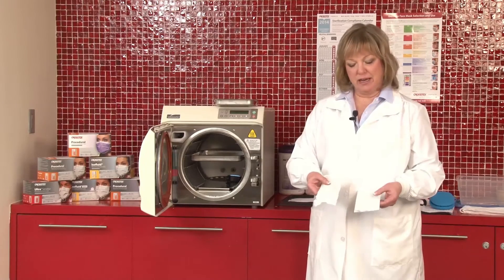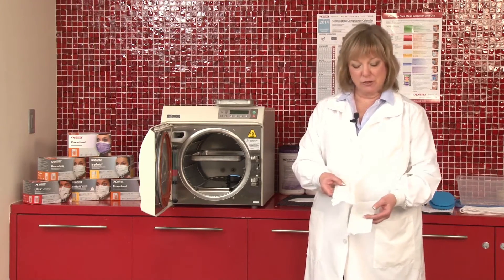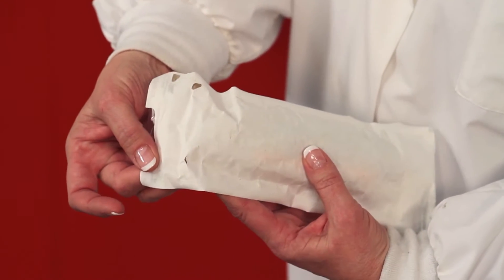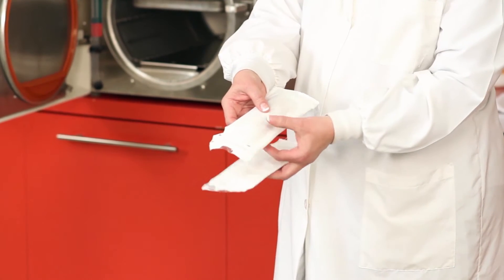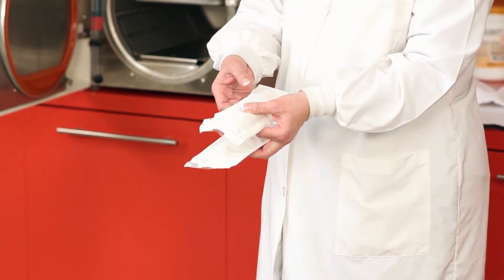Before we use an instrument pack, we should always examine it carefully to make sure that there have not been any punctures or tears. For example, at the top of this pack, you can see that a puncture has happened, but until you look closely, you won't notice it. You also want to look at the side areas for any crinkling or tearing that may have occurred during the process.